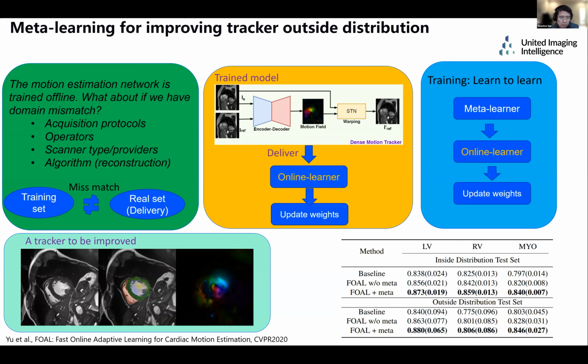And we repeat this procedure for different videos. But since this is online, having already deployed onto those videos, the speed is something we have to consider. The fine-tuning is slow. How can we improve the speed? We came up with a meta-learning based method.